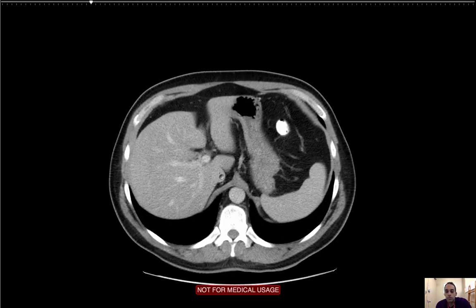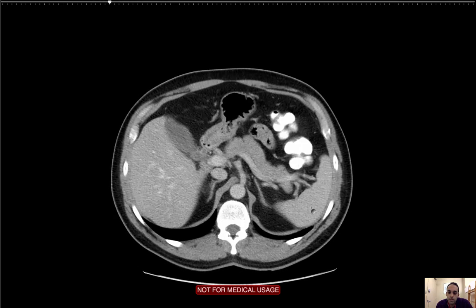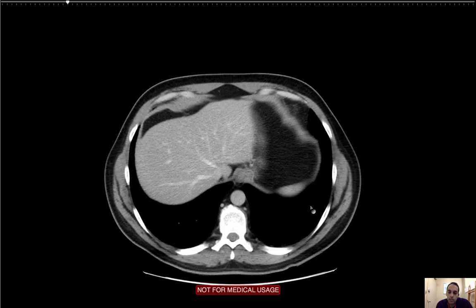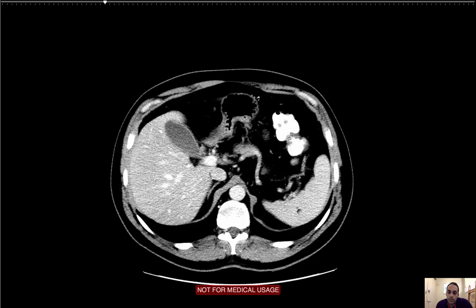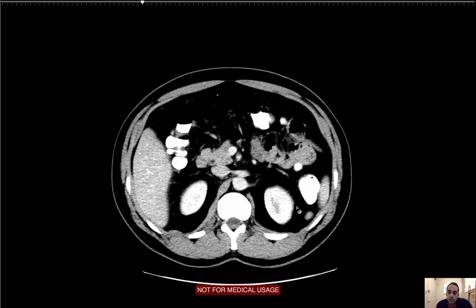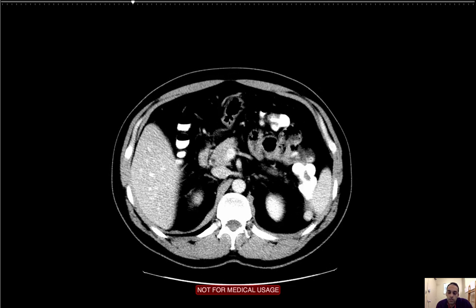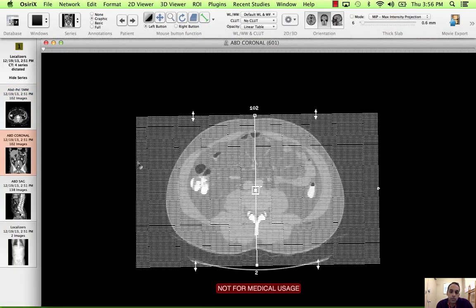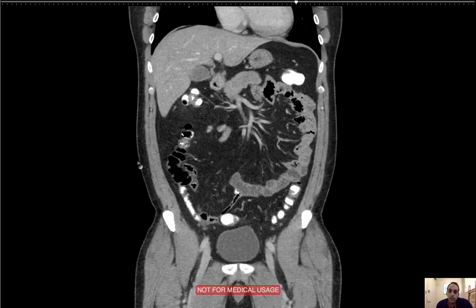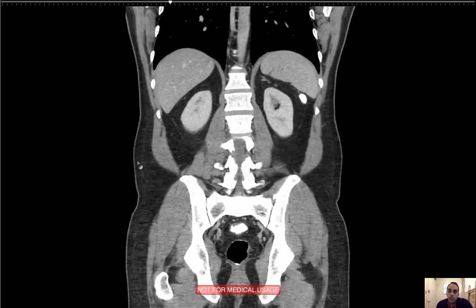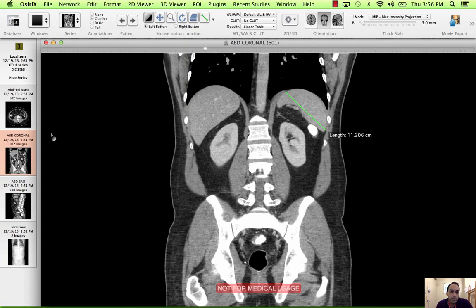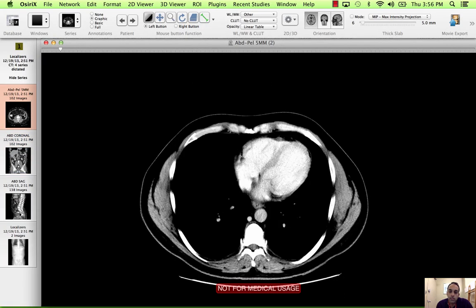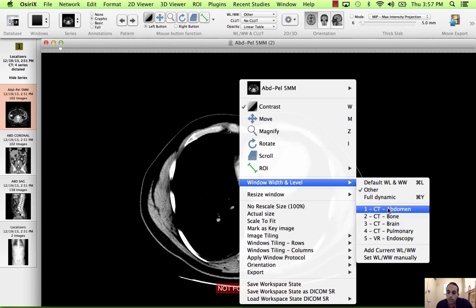Next on the checklist is the spleen. I'm looking for focal lesions and size. I'm going to narrow the windows to increase my sensitivity for focal lesions. I am seeing a small normal finding — a splenule here just in the splenic hilum. I'm going to get a measurement on the spleen to look for splenomegaly, in case the spleen is infiltrated from metastatic disease or otherwise. This is a normal spleen measurement — 11 centimeters. So there's no evidence of splenomegaly, no focal splenic lesions.